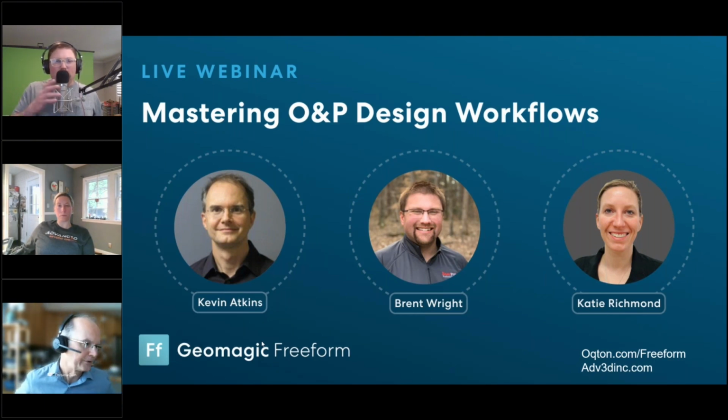And let me just talk on that real quick. So yes, there is a cost to Freeform, and I have a nonprofit as well. And so I think, yes, maybe you work with it, but there's also nonprofits that we have worked with that have fundraised to create the ability to do the license, and then they use it.